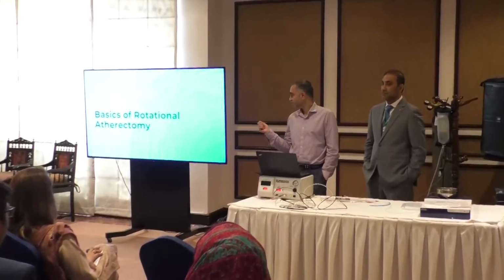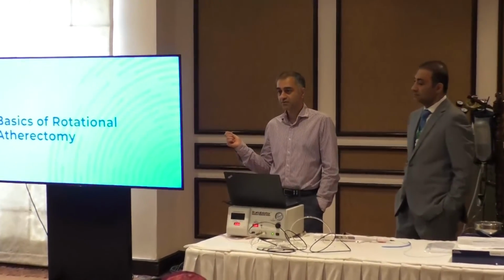So the first part, we'll just go through some basics of rotational atherectomy, discuss some cases, and then do questions. Quick show of hands, has anyone used rotation before in their practice? Nobody? A few cases? Yeah. So a few cases. Anyone else have some experience with it? Yeah. Okay, good. Well, where do you work? Oh, I see. Okay, so you will have seen rotation before.